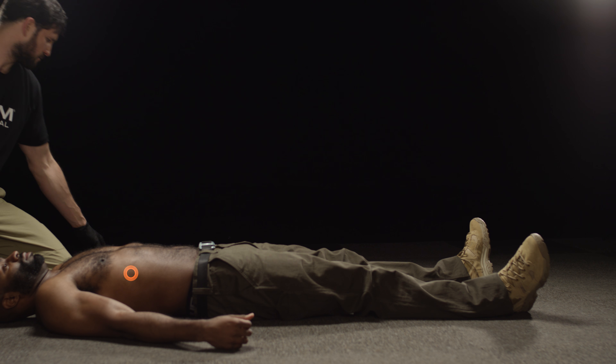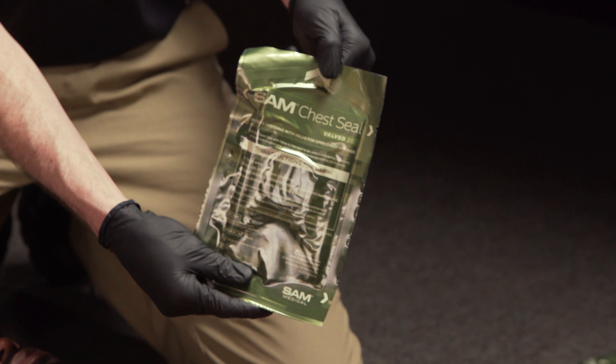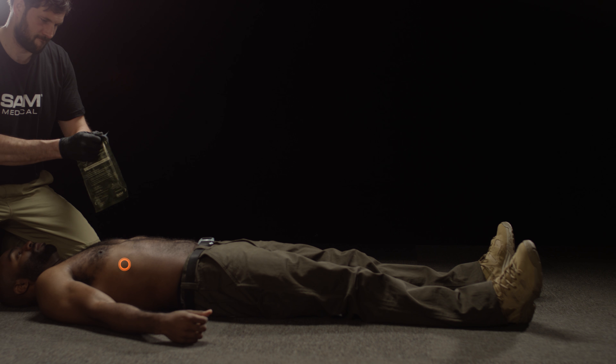Locate the wound. Remove the patient's clothes and run your fingers on the chest and back of the patient to ensure you have located all wounds.